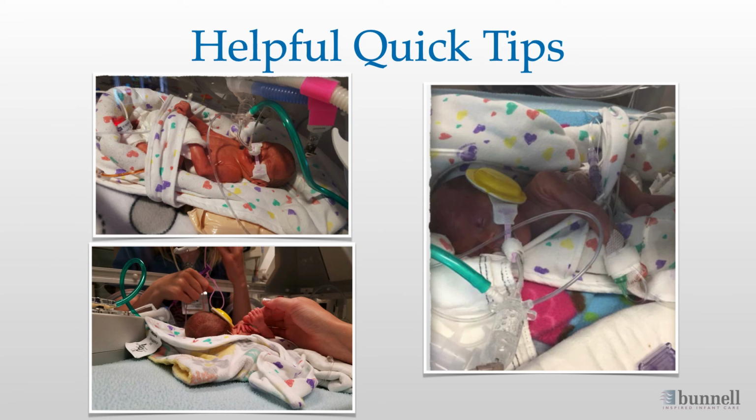Upon assessment, look for adequate bilateral chest wiggle, less pronounced than if you are familiar with oscillation. There are no restrictions on patient positioning. Babies may be rotated from side to side, be placed midline, prone, snuggled, etc. It's appropriate to use gel pads, sheepskins, soft linens, or positioning aids of your choice to create a comfortable environment for them. During HIE body cooling, both the conventional ventilator and jet gas should continue to be heated and humidified to prevent airway damage. It isn't necessary to sedate patients for breathing above the ventilator.